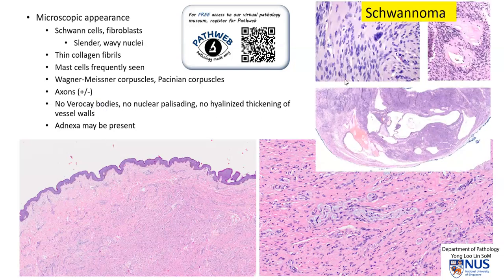Unlike the schwannoma, usually in neurofibromas we don't see really significant nuclear palisading or Verocay bodies. We can see nuclear palisading in a schwannoma. The blood vessel walls in schwannoma are very hyalinized and thickened, which is not generally a feature of neurofibroma. Trapped adnexal structures may be present, as demonstrated earlier.